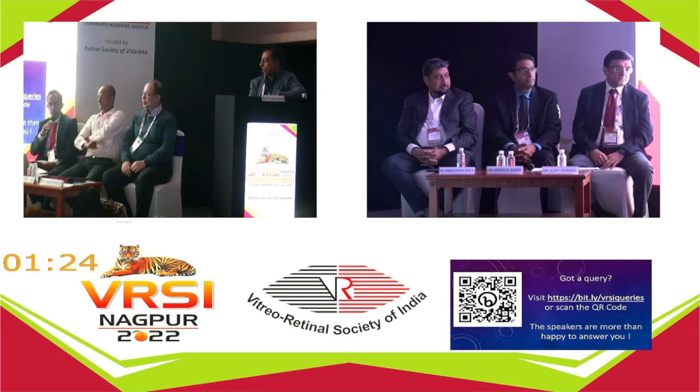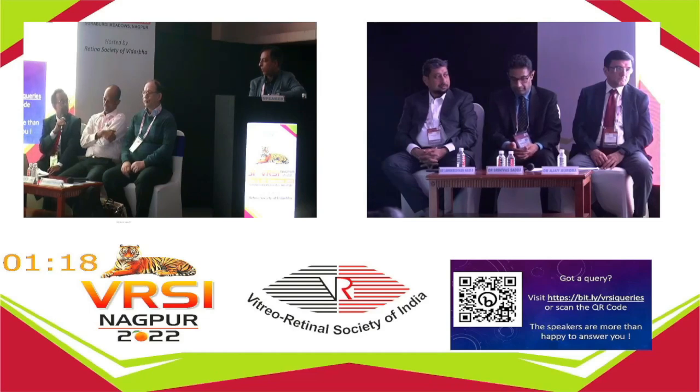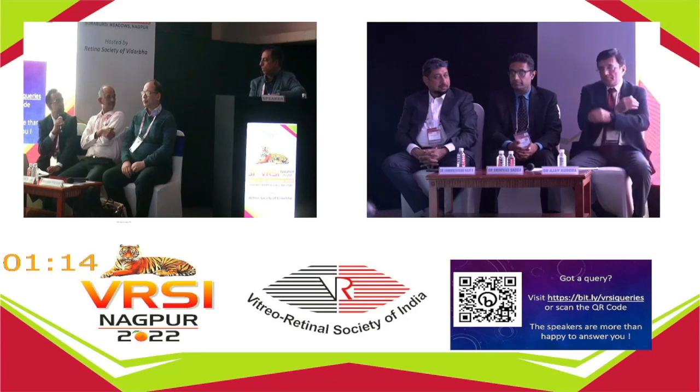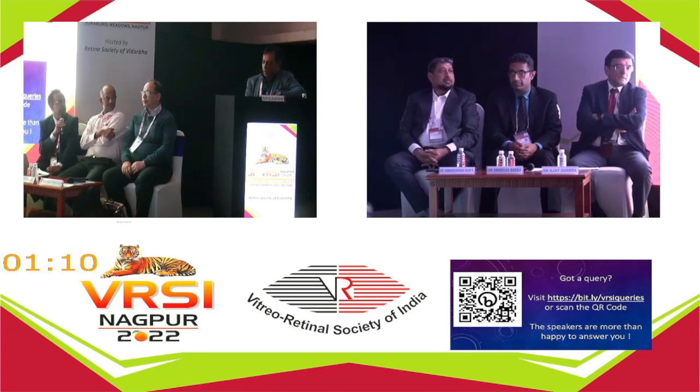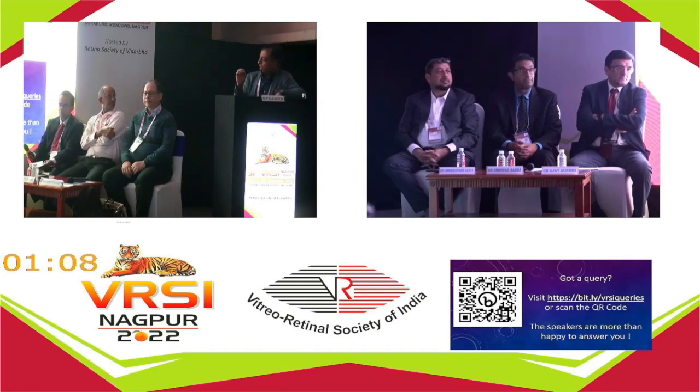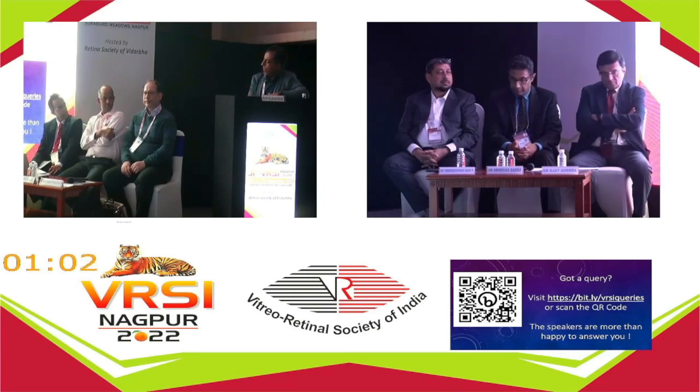Amazing picture. I had another question about the retro mode, which fascinates me a lot. Have you used it in CSCR or any such diseases where there are recent publications in which they found it very useful and in fact superior to FAF? Well, it picks up small excrescences very well. Drusen and drusenoid lesions are picked up very well on it.